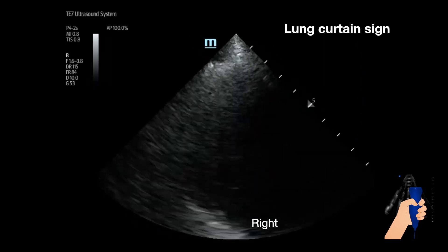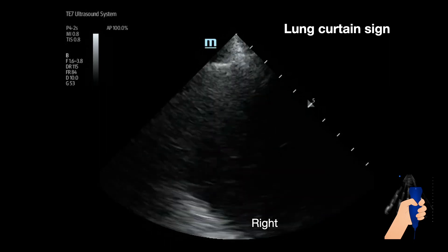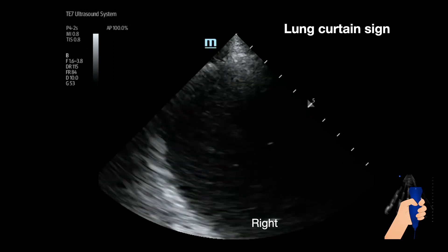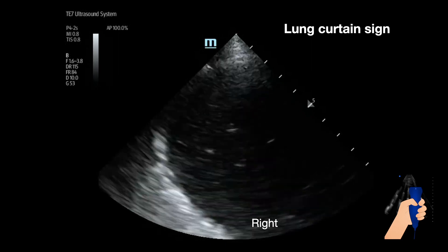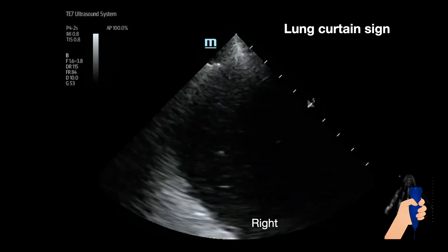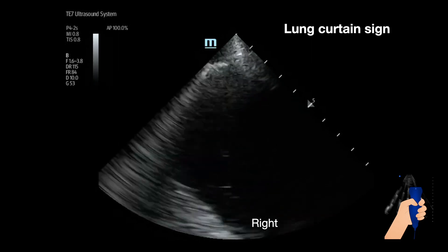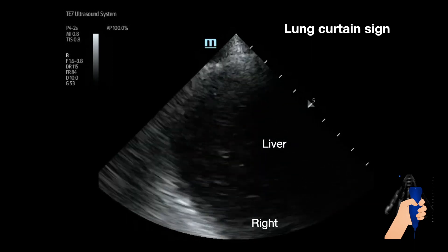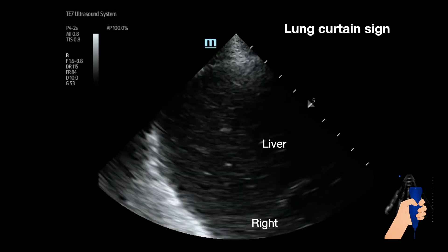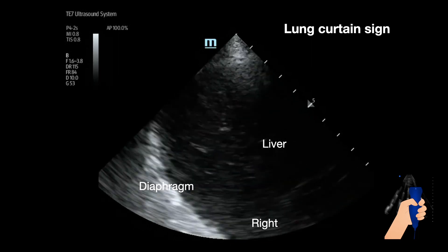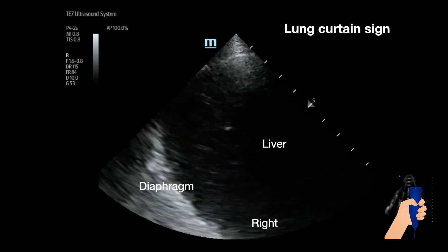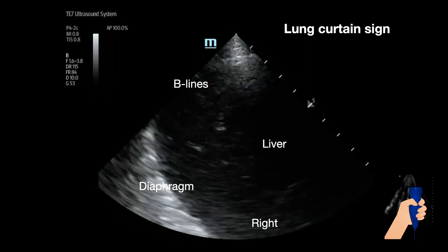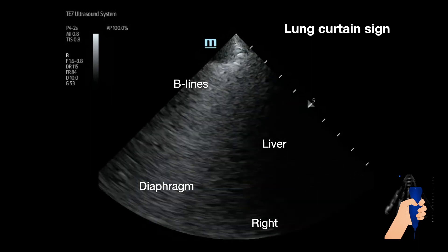Here we see a lung curtain sign again from the right side. This time, instead of a curvilinear probe, we are using a phased array probe in lung mode. You can see the liver moving with respiration and the diaphragm. Then B lines — this patient had ARDS and no pleural effusion.